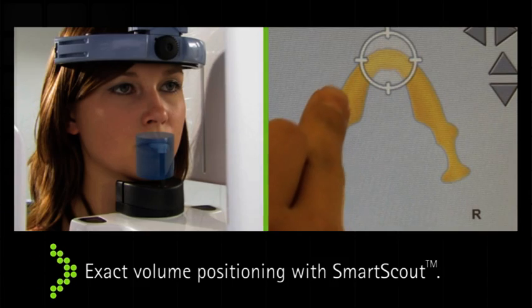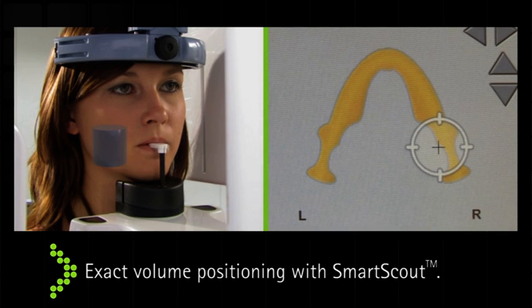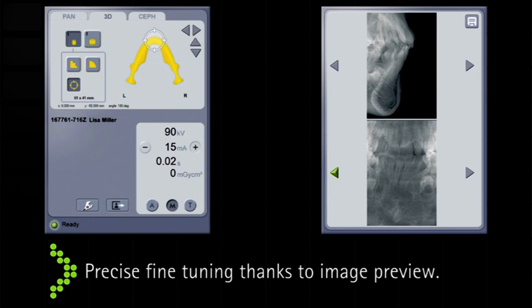With the innovative smart scout function, the x-ray volume is easy and precisely positioned. The system automatically adjusts to the set position. A two-dimensional scout image allows you to have a precise orientation on the region to be assessed. This means you can save valuable time to completely dedicate yourself to your patients.